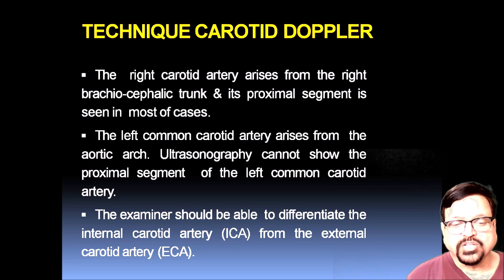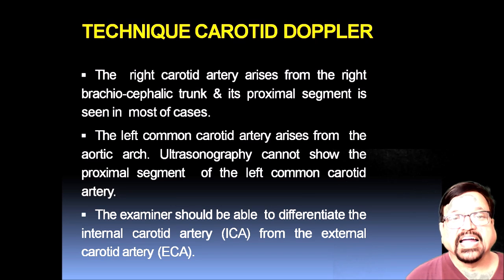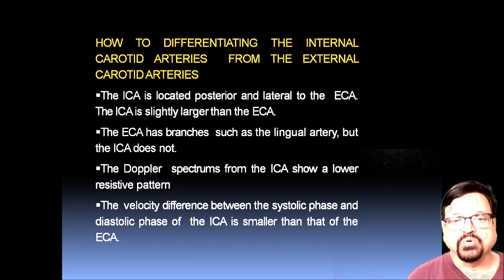The examiner should be able to differentiate the internal carotid artery from the external carotid artery, and there are techniques which we are going to state and show you as the slideshow goes ahead. Now, how to differentiate the internal carotid arteries from the external carotid arteries?